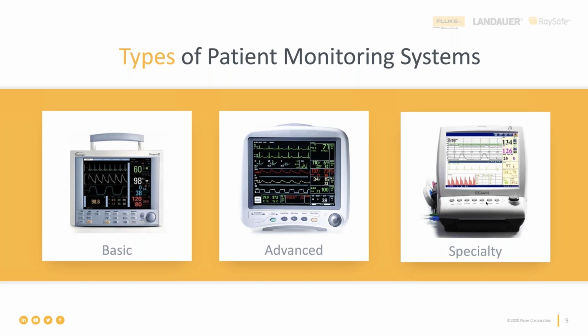And then there's a third bucket. These are specific kinds of patient monitors used in the pregnancy care or maternity center. The fetal maternal monitor will have special parameters to measure mom and baby, in addition to some of the basic vital signs. These may measure non-invasive blood pressure, SpO2, in addition to both fetal and maternal ECG. They may measure intrauterine pressure, IUP, to measure the contractions, or a tocodynamometer, a TOCO, to measure the tension of the abdominal wall, which gives an indirect measure of IUP.